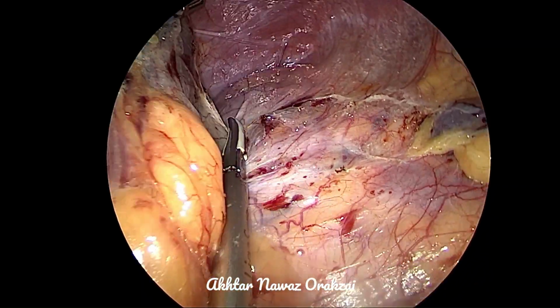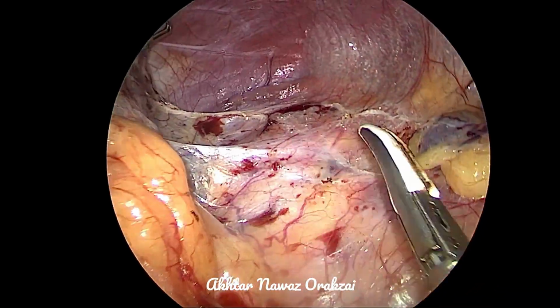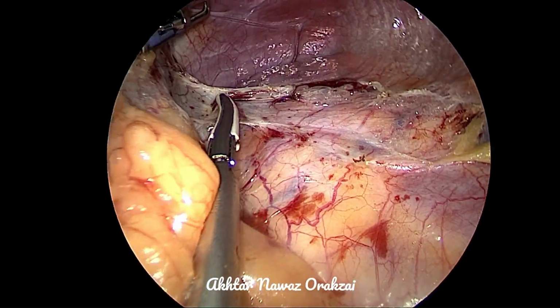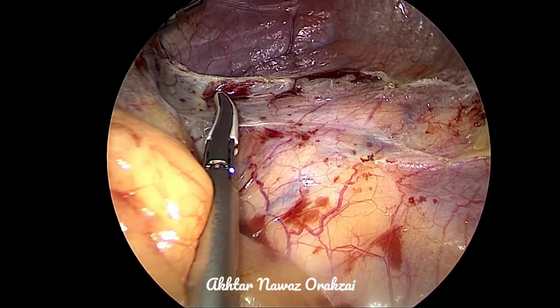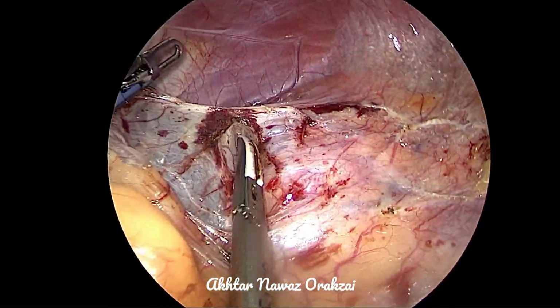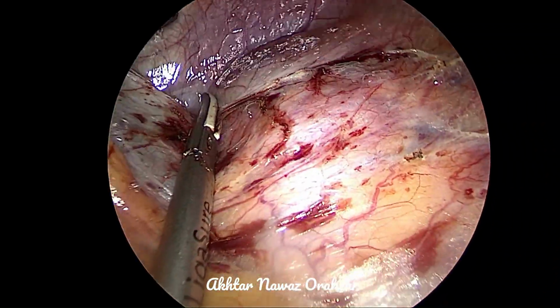So once again I would emphasize that mobilizing the spleen up till the left crus of the diaphragm will just drag the colon due to its weight, the weight of the spleen.